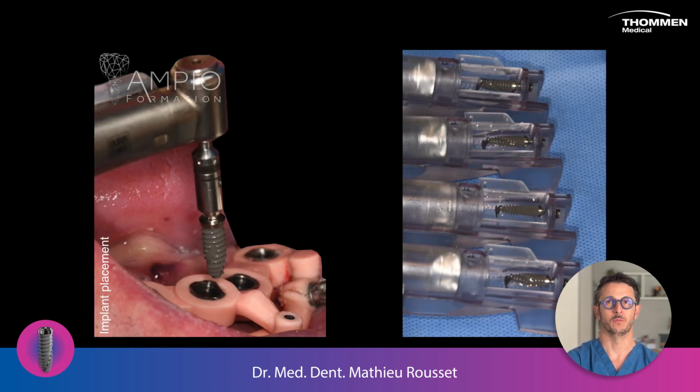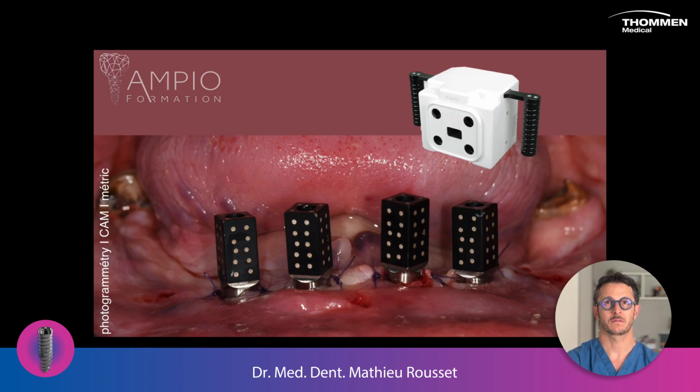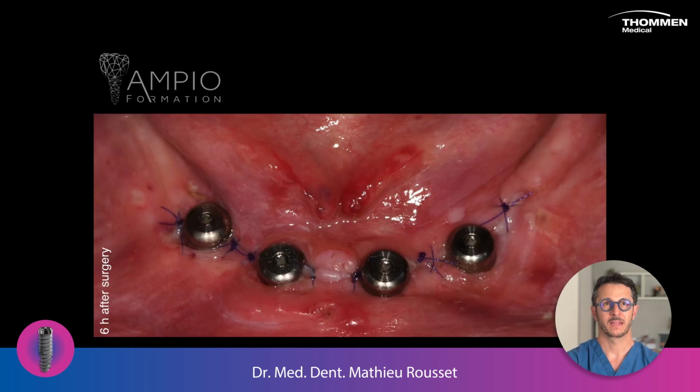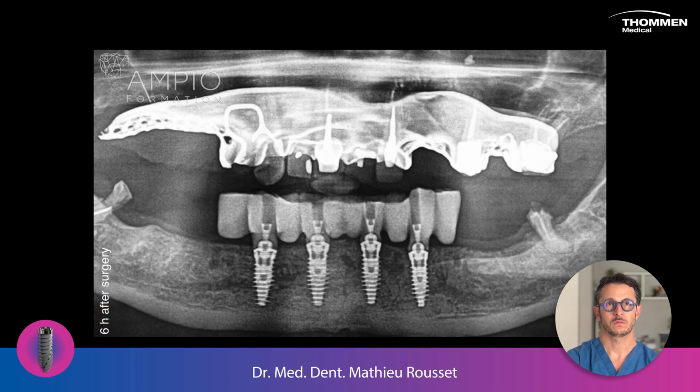The implants are screwed through the guide. We made the optical impression, then the photogrammetry. The temporary bridge is fitted in our office. The patient is called again at the end of the afternoon in order to screw in the bridge. That's the clinical situation in the evening. The X-ray control.